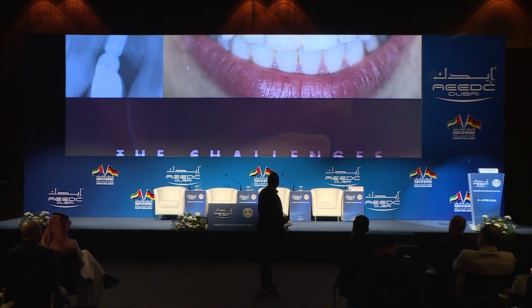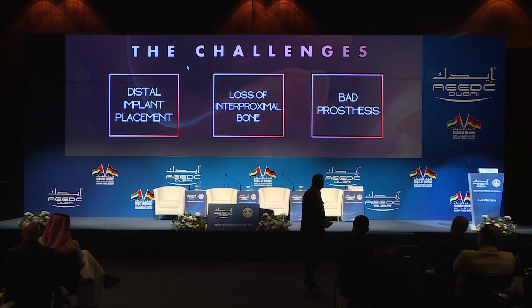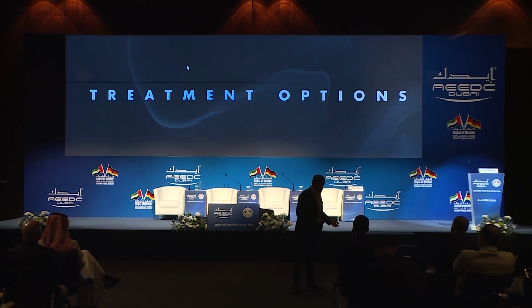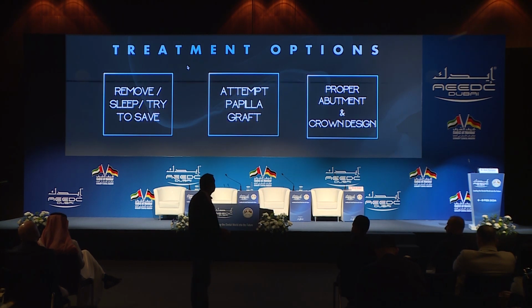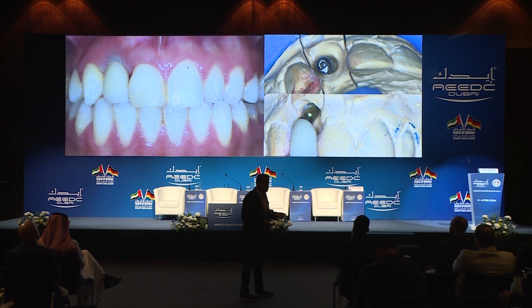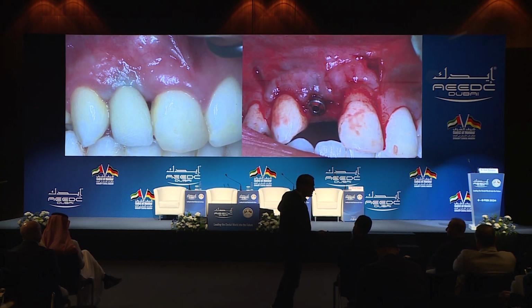Thank you. Okay. So when you look at the challenge in this case, the implant is placed too close to the tooth next to it, too close. And when you look at the treatment options, you can always remove the implant. If I had to see the case today, probably I would remove the implant and start all over again. But this patient didn't want to go through this. She said, can we do something about it? I said, yes, we can try, because I'm coming to Dubai, so I want to show my friends what happened.